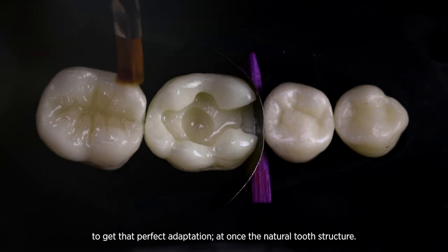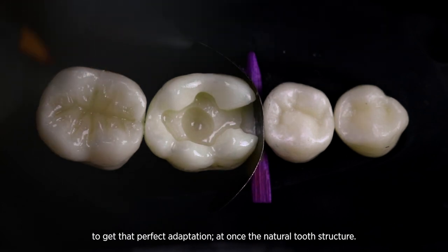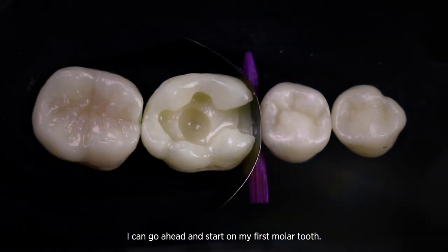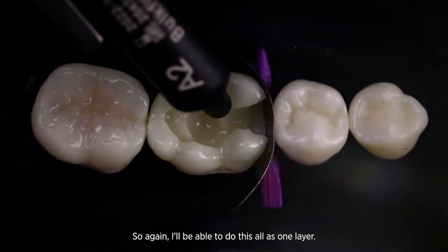You'll just see the way that this resin beautifully adapts to the tooth. Then I can go ahead and start on my first molar tooth.